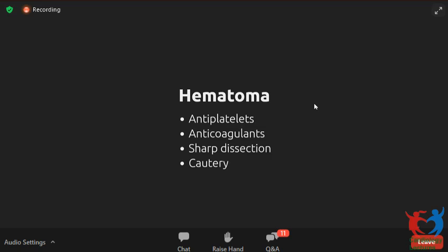For obese patients, the only thing is, if you're going to dissect for the cephalic vein, sometimes there's a lot of fat that you have to dissect through. So you can decide beforehand whether you want to do that or go directly for puncture. And in obese patients and some of the women, you have a lot of subcutaneous fat, and the pocket sometimes tends to become made of fat. You should try to avoid that. You should get below all the fat, reach the fascia, and make the pocket over the fascia.